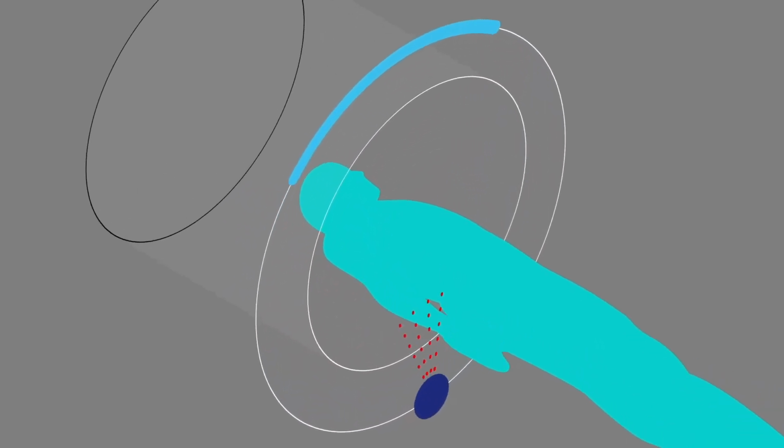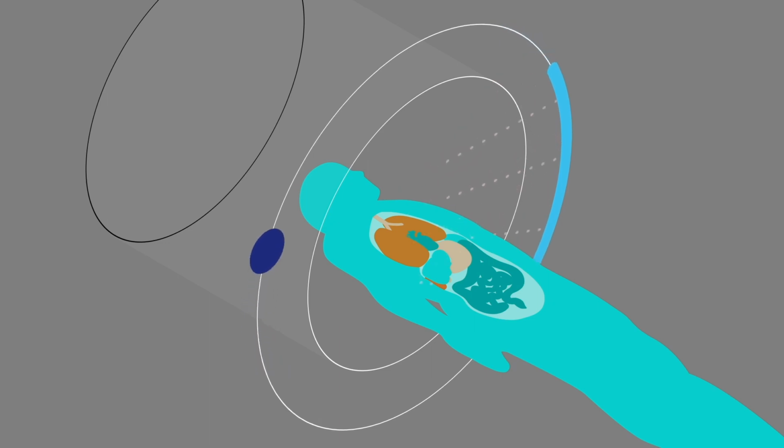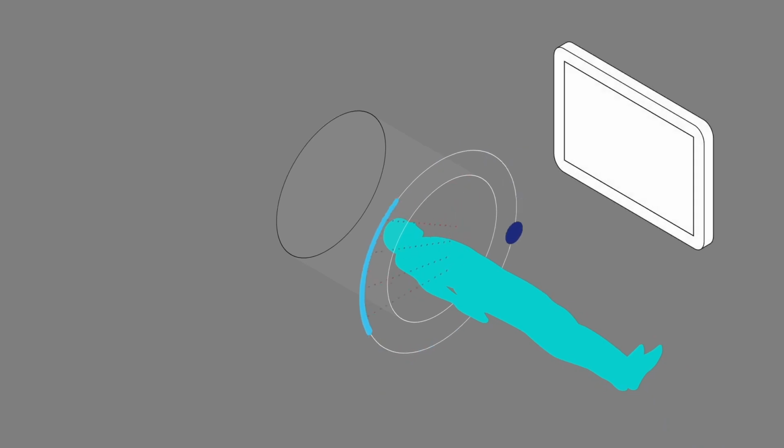During a CT scan, the patient lies on a table that then slides into the scanner. As the patient enters the scanner, the integrated X-ray source rotates, continuously emitting X-rays that penetrate a given part of the body from every angle. Organs and tissues in the body attenuate the X-rays to different degrees. The rays that pass through the body hit detectors and are converted into electronic signals. These signals allow the computer to calculate an image.